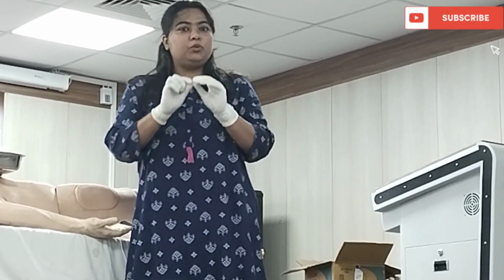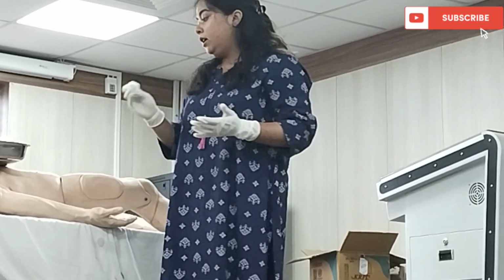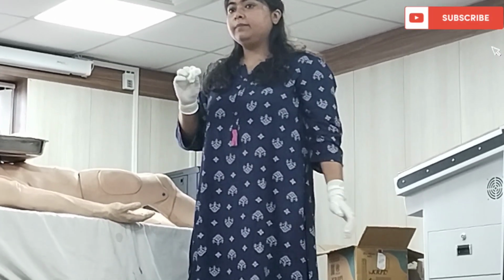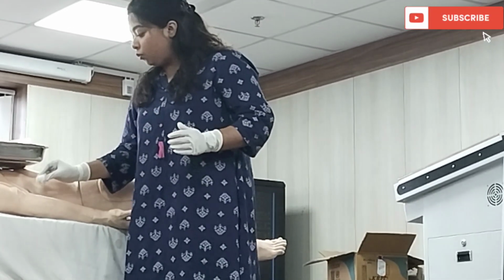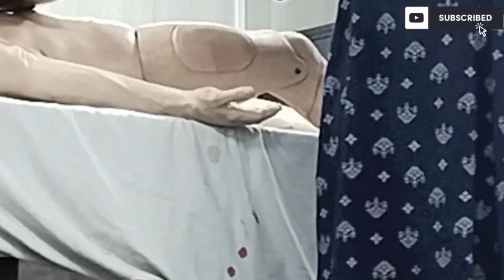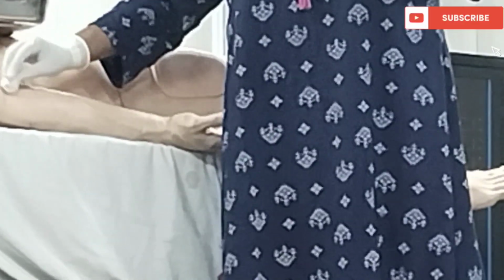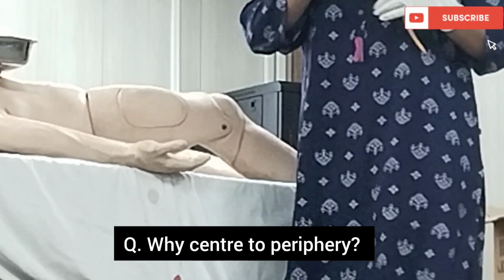Any prominent vein, you have to make the vein prominent. What are the procedures for that? Before that, you will take the spirited cotton and wash the site of blood drawing. You don't have a drape or anything for blood drawing purpose. While washing, just wash it from center to periphery. Very easy, because if you go from periphery to center, then you are drawing the dirt from the periphery to the center. So from center to periphery in a rubbing fashion, you clean the area.